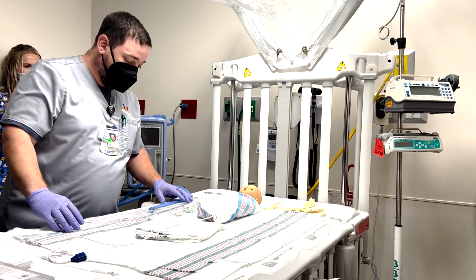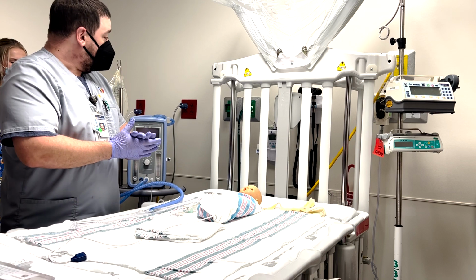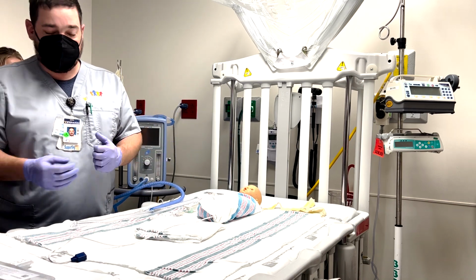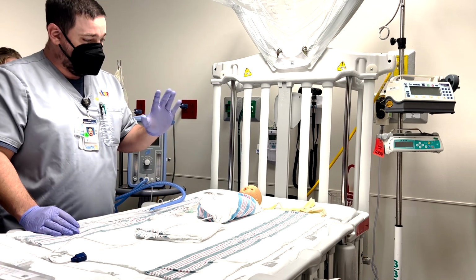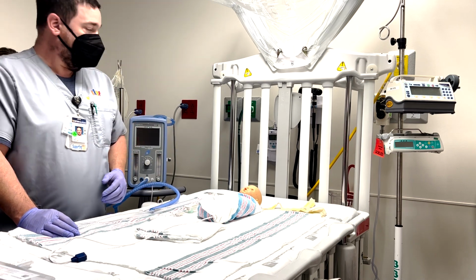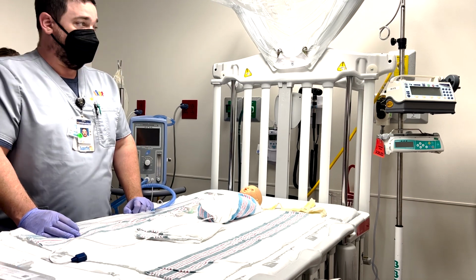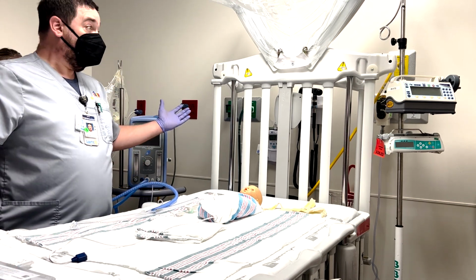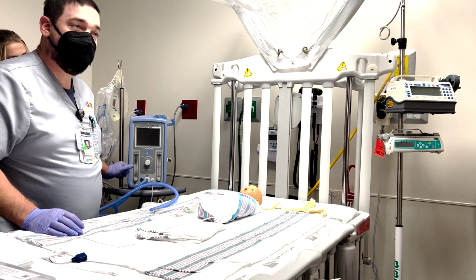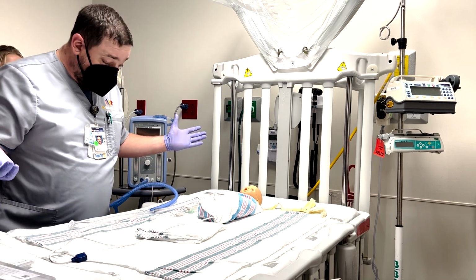We want to decrease airway resistance. So far, you with me? So when it comes to, we'll say, high flow on a 9-kilo child, we figure we'll just make math easy here. 2 liters per kilogram, you know your max flow is 18, correct? You get to use smaller flows at this point. You don't really need 18 of flow. You do that, you're going to have a PEEP like 15. They really don't need that high. So generally speaking, you'll see more to about 8 to 10 liters, which is good. But again, your nares are sealed off, which is what we're supposed to be doing.